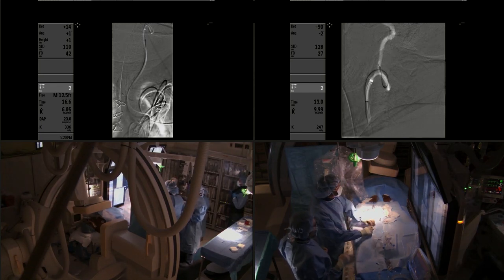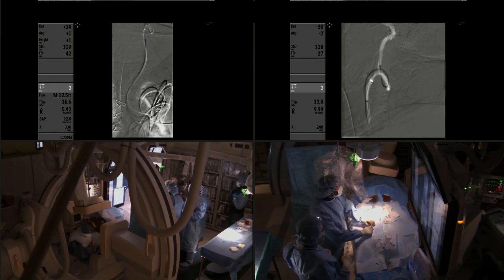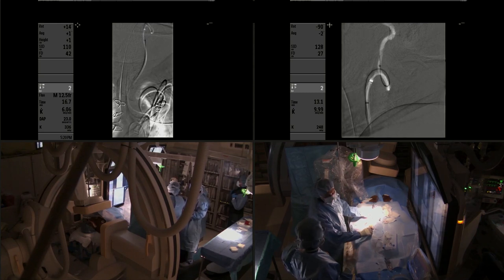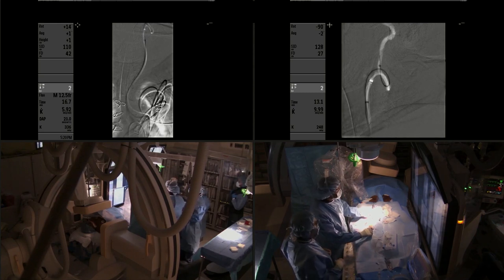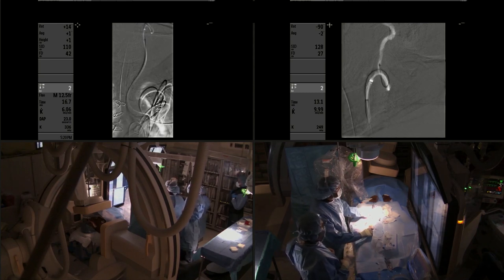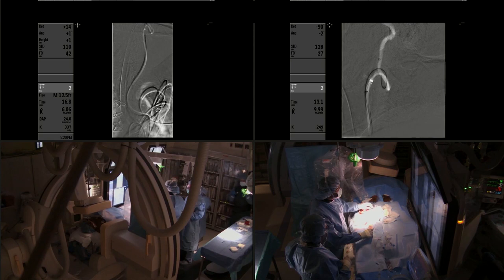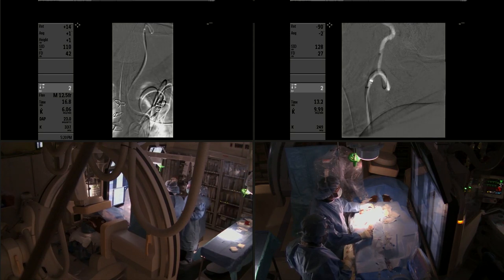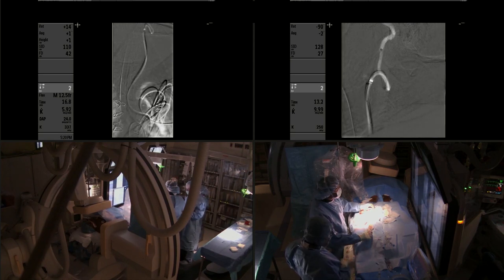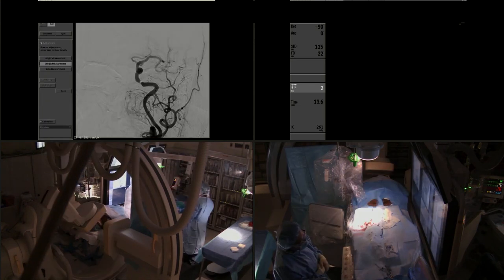A 5 French Navien 058 by 115 centimeters, and with the support of an Excelsior XT27 over a V18 microwire, you can see how we're making the loop and going into the distal cervical segment of the internal carotid artery.